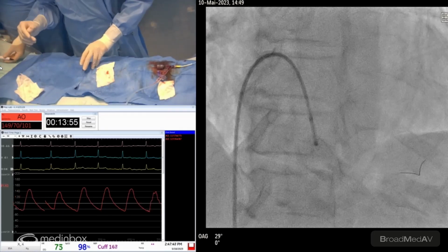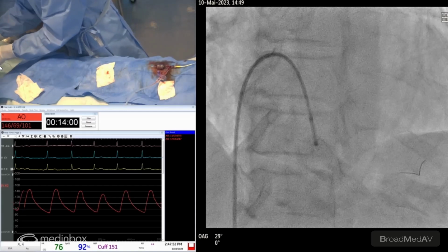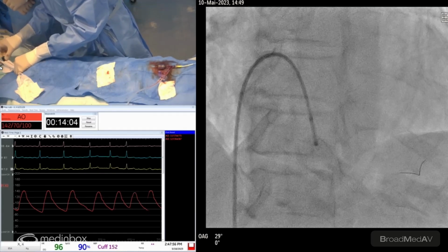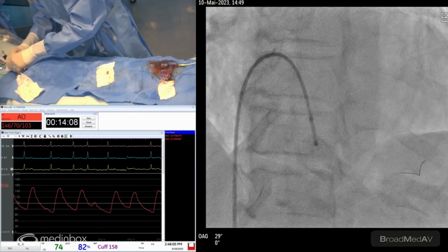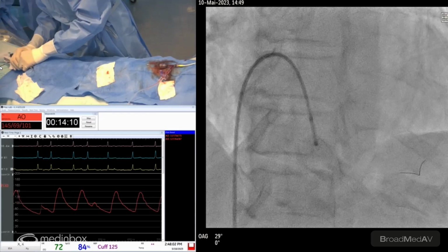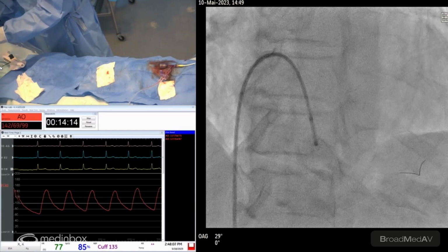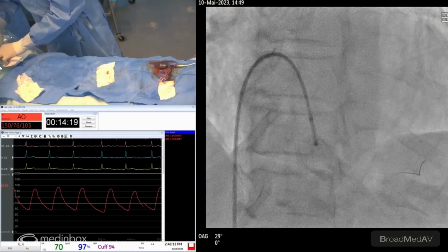So you need to stop the drip so we don't get everything wet. I'm going to stop the drip. Then make sure you bring the advancer all the way forward so you don't kink anything. We can't see. You take off the yellow sleeve and you pull. Can you zoom in on my hands, please?